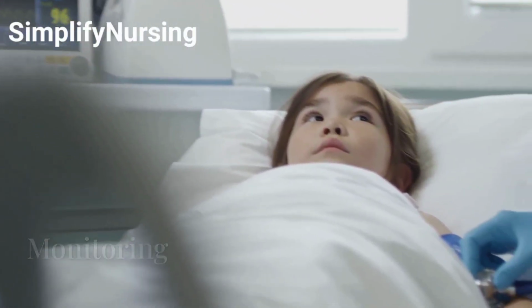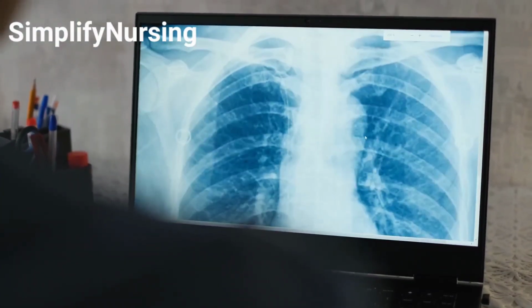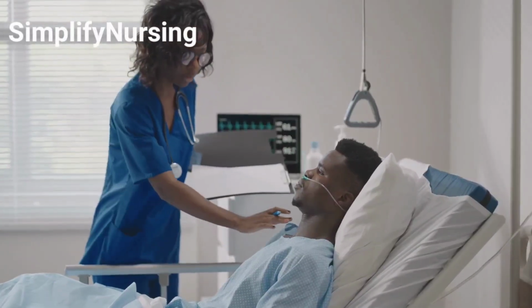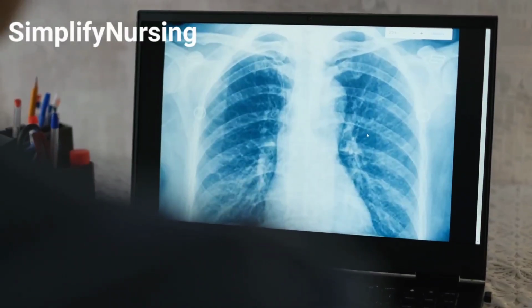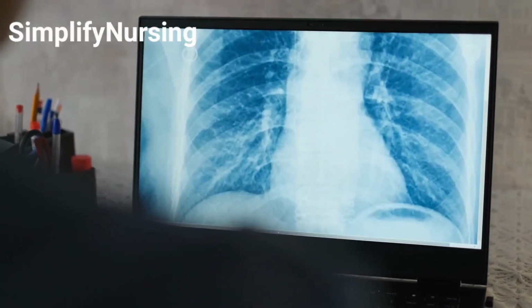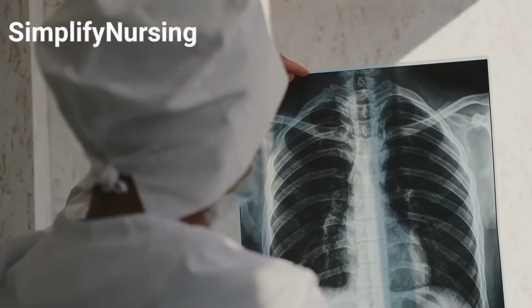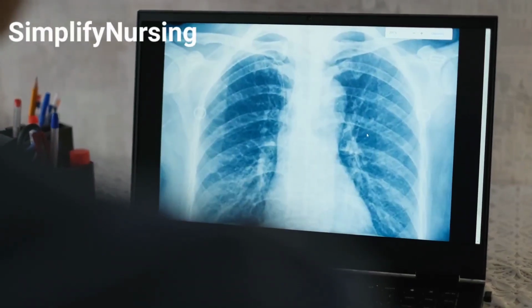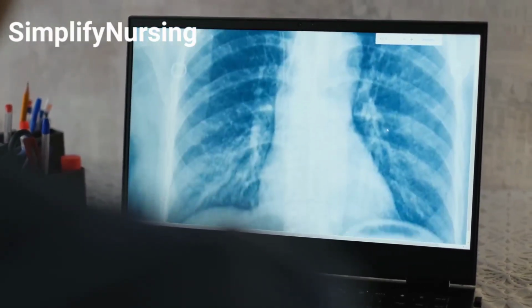Alright, let's talk about monitoring. It's crucial to assess respiratory status regularly. That means checking breath sounds, respiratory rate, and oxygen saturation. You should also keep an eye on the amount and characteristics of drainage, including its color and consistency. Don't forget to check for bubbles in the water seal chamber, as this can indicate an air leak. Finally, always observe for signs of infection at the insertion site.